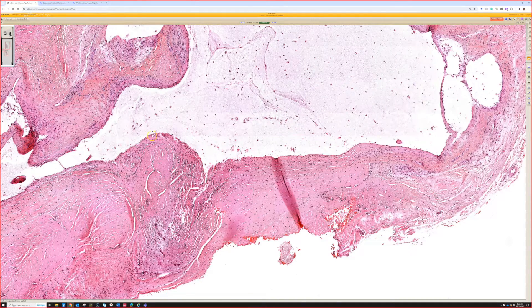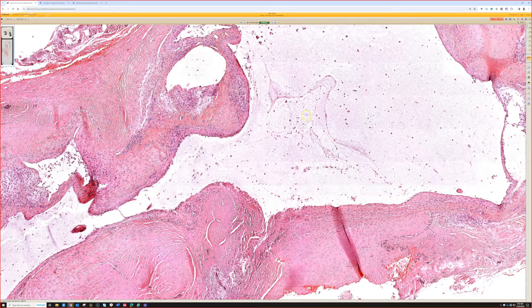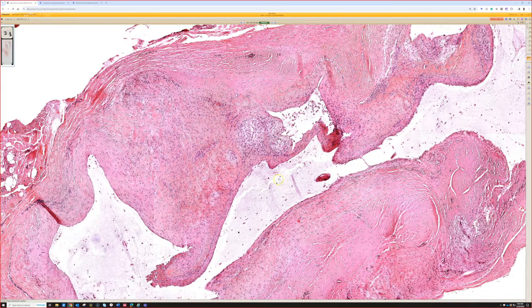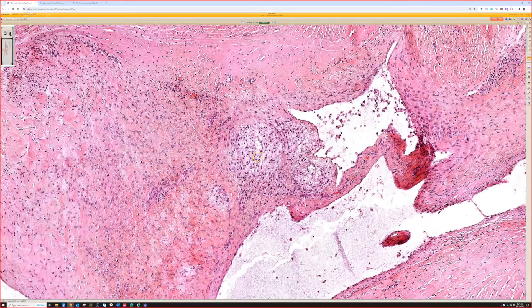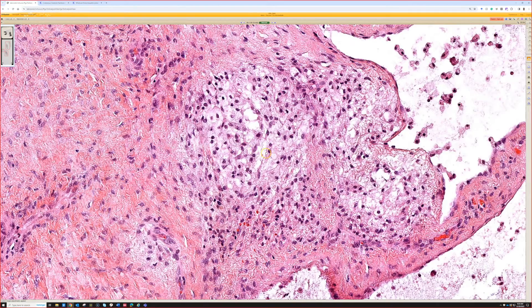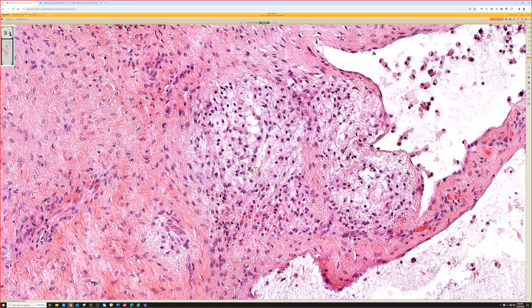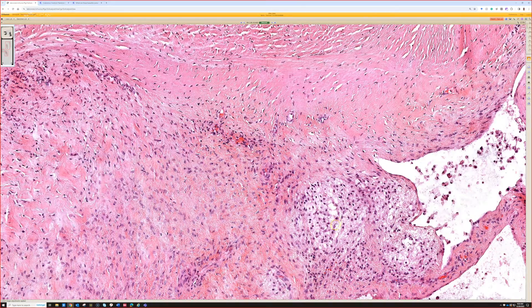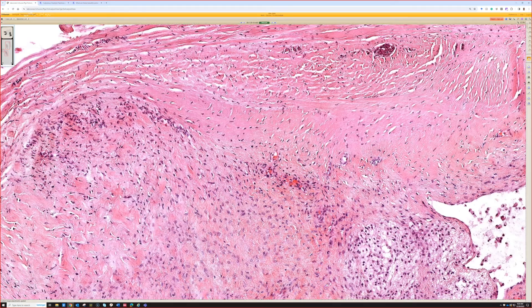There can be a lot of reactive change in ganglion cysts and bursas. Also, the synovial fluid can wash out during processing, leaving the cyst completely empty and clear. Sometimes the mucin leaks out of the cyst and infiltrates adjacent tissue, giving little pockets of loose, edematous or myxoid areas, often with small foamy muciphage-type histiocytes. This can be so abundant that it resembles the changes seen in a myxoma. If I just see fibrous tissue with myxoma-like change and no cystic area or synovium, I'll still note these changes could represent tissue adjacent to a joint, bursa, or ganglion cyst.